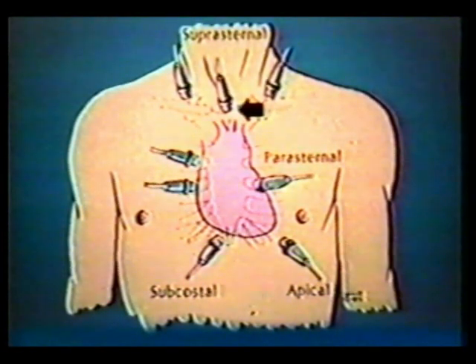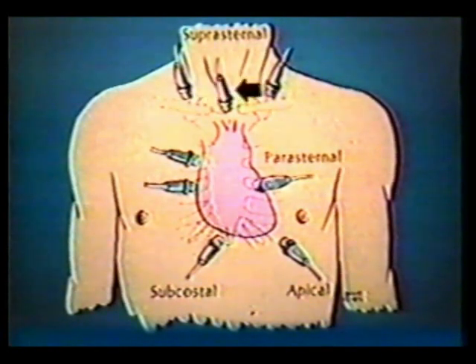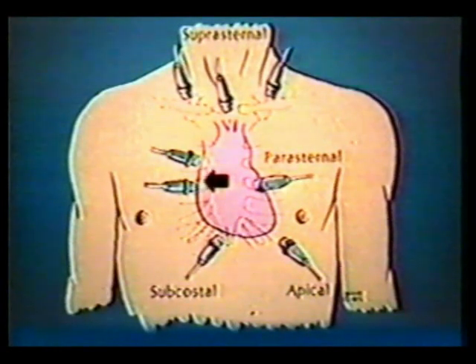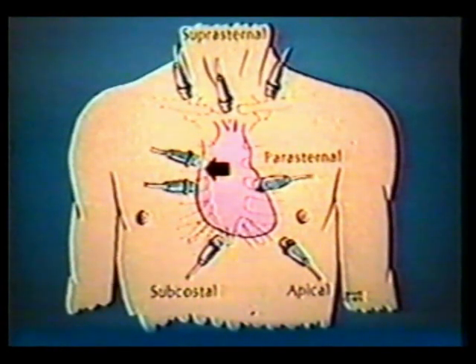Individual cases may require additional transducer locations, including the right and left supraclavicular and the right parasternal positions. The latter are particularly useful for Doppler interrogation in aortic stenosis.